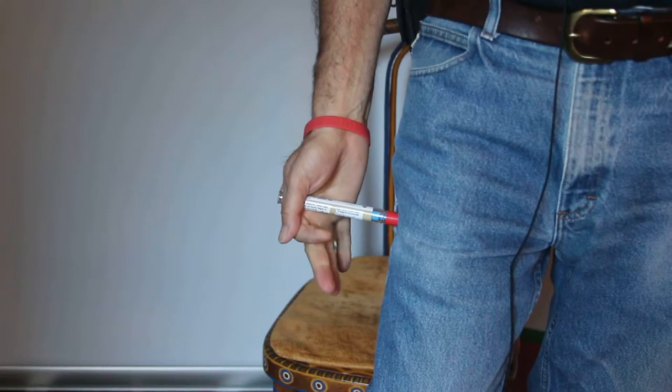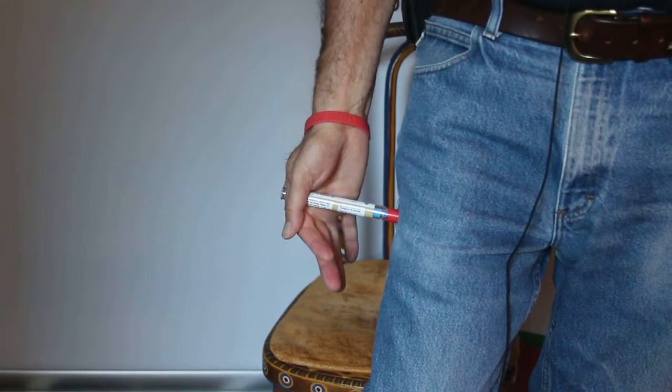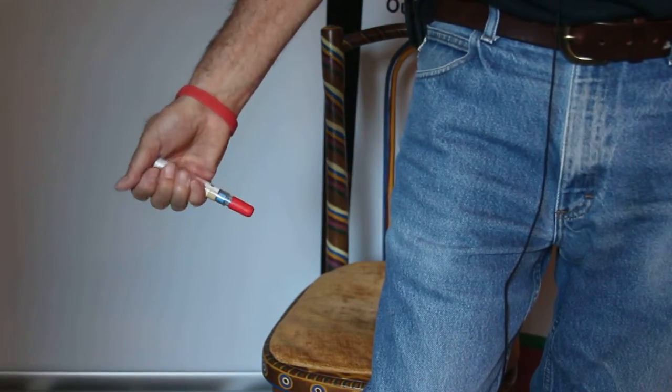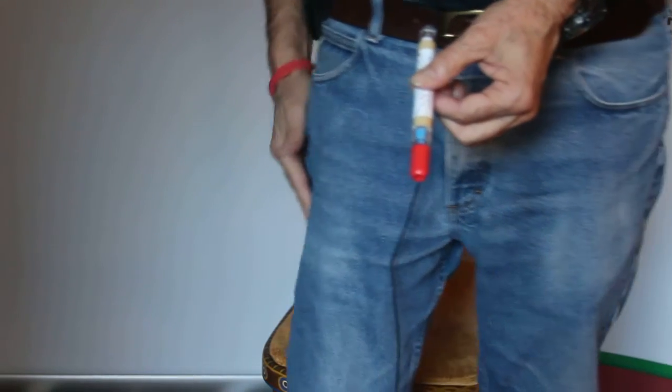1, 2, 3, 4, 5, 6, 7, 8, 9, 10. Withdraw it straight out. Keep your finger away from the red tip and massage this for another 10 seconds.